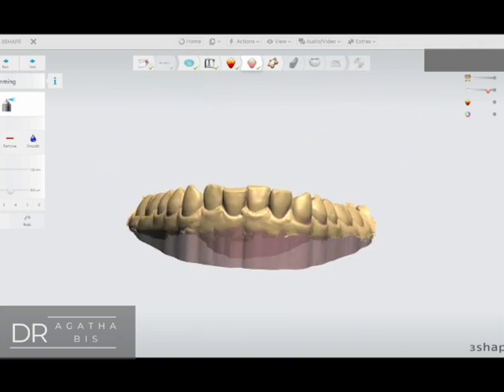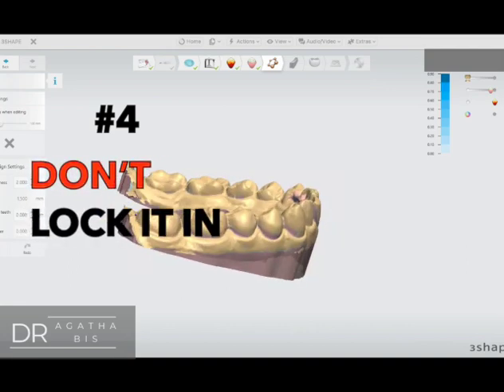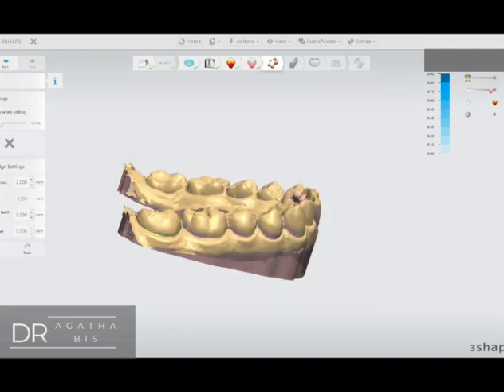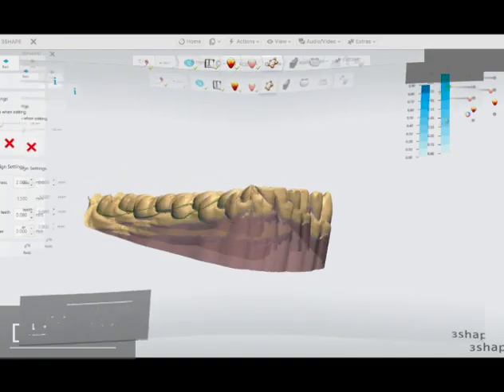Number four: create retention but don't lock it in. I will often go around the model and remove a little bit of wax just so I can create a button for retention. But if you remove too much, it gets locked in and it's really hard to remove.